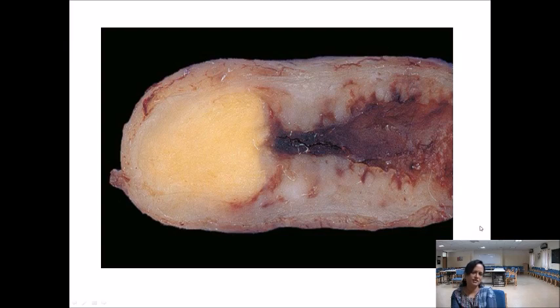The tip of it, which is cut longitudinally, and what do you see? This is the lumen. Lumen has hemorrhagic material here. See, all these are the congested blood vessels. Okay, lumen has got a yellowish mass. What is a yellowish mass, well circumscribed like this? All of you know about lipoma, which is a benign tumor of adipose tissue. But no, I told you at the tip of the appendix, a yellow tumor that occurs is carcinoid.